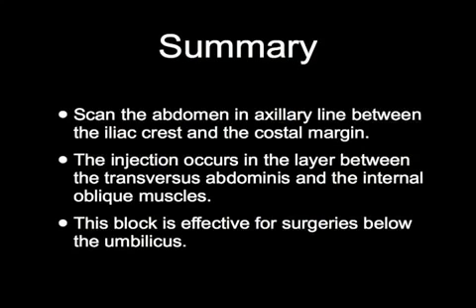Summary. Scan the abdomen and the axillary line between the iliac crest and the costal margin. The injection occurs in the layer between the transversus abdominis and the internal oblique muscles. The block is effective for surgeries below the umbilicus.